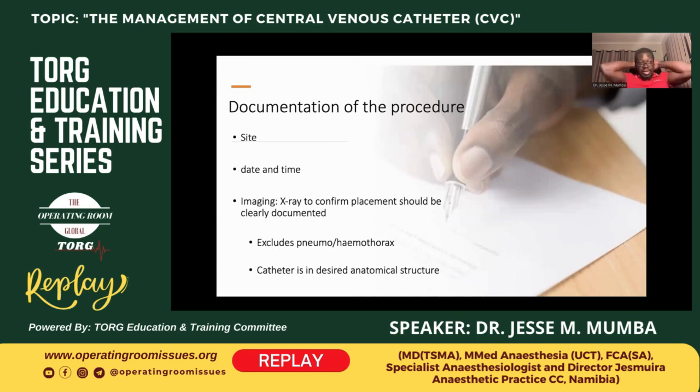So in the attempt to make sure that we are on top of our game as far as reducing infective complications, you need to document what you have done, and everything else that you have used needs to be documented. So you need to document the site, the date, and the time, because remember at the start we mentioned that certain lines are meant to be used for certain days.